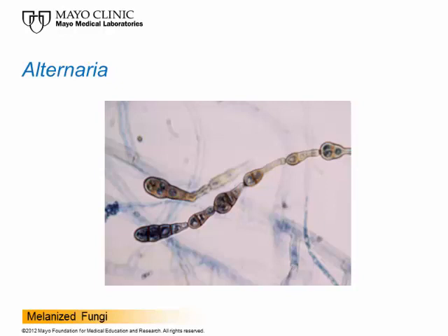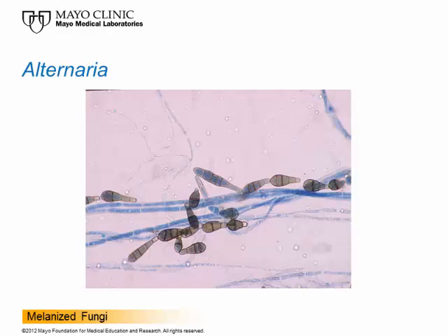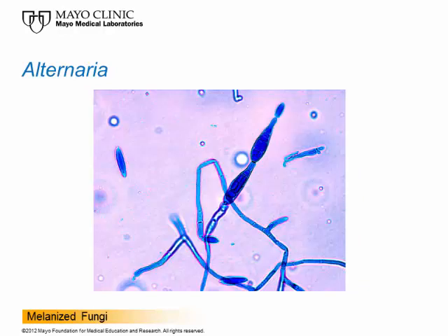This next slide shows Alternaria with some spores in chains. It can be a little difficult to tell if there are both kinds of septations. You would look around the whole slide to see what the predominant presentation of the conidia would be, and you would likely find areas showing horizontal and longitudinal septations. These are probably young conidia. Sometimes it's difficult when specimens get overstained with lactophenol blue, but on the top cell you can see the horizontal and longitudinal septations.